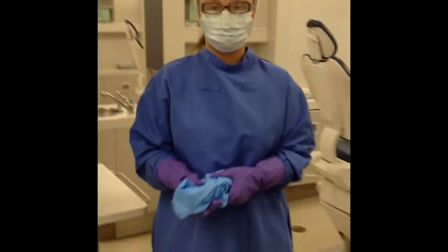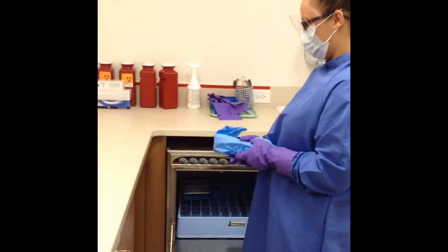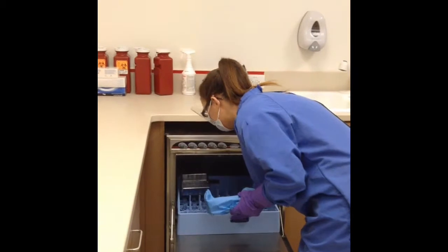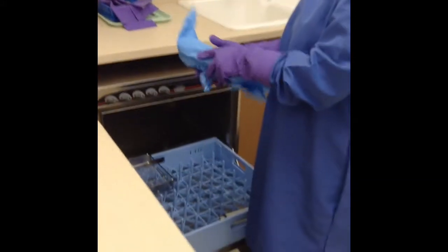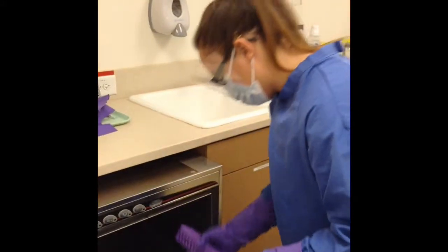We are now going to go to the sterilization room. We are now ready for the pre-cleaning stage and we are going to be using the instrument washer. Krista is going to demonstrate how to properly load and start cleaning. This stage is used for removing the bioburden from the instruments. She already has a blue towel laid out over the sink to place the instruments on once the cycle is complete.